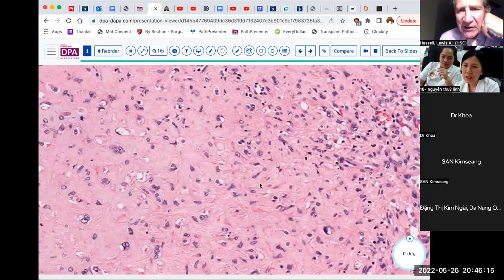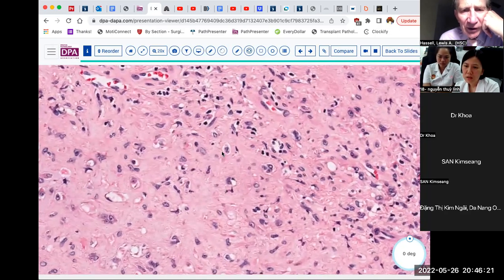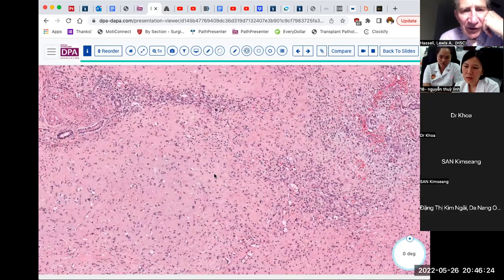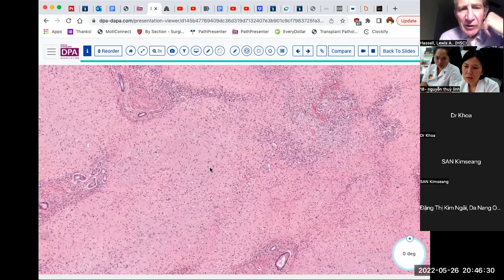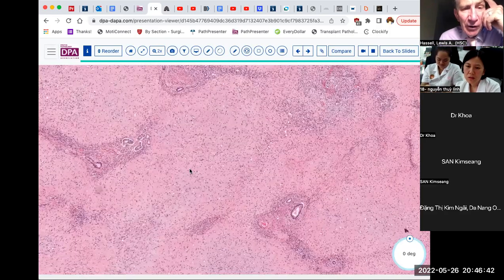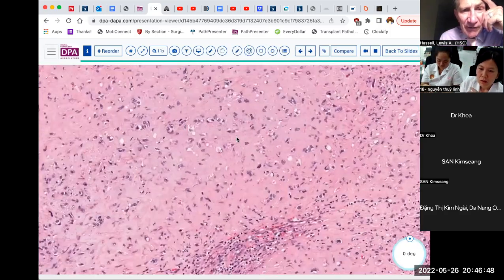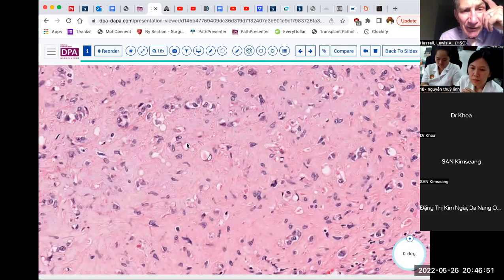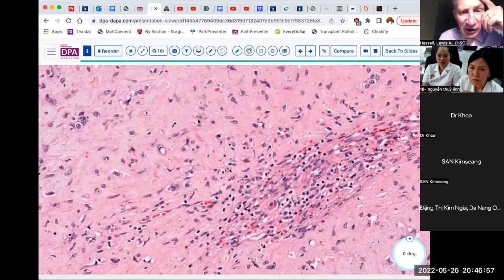The liver is one of the common sites where this tumor occurs. Bone and lung are also sites where this can occur, as well as other soft tissue sites. And it can have a variety of morphologies. We had a case that was resected recently from the back, which had a very spindly type of appearance, a very homogeneous eosinophilic epithelioid pattern, whereas this is much more of a stromal pattern with these variably spaced cells and prominent cytoplasmic vacuoles. And, you know, it doesn't look particularly vascular.